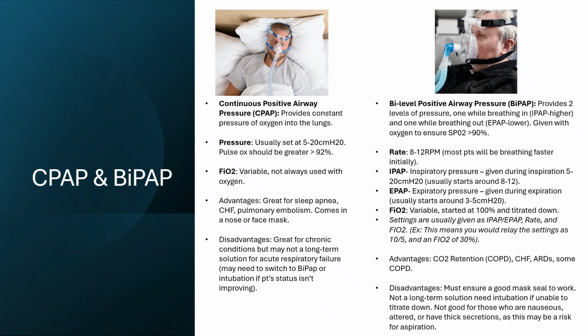And usually it's 5 to 20 centimeters of water. Most of the time people start around 8 to 12. It's pretty common to be at 10 when you first start out. Your expiratory pressure is just a little bit of pressure that's given during expiration, usually around 3 to 5 centimeters of water. And again, your FiO2 is going to be variable.